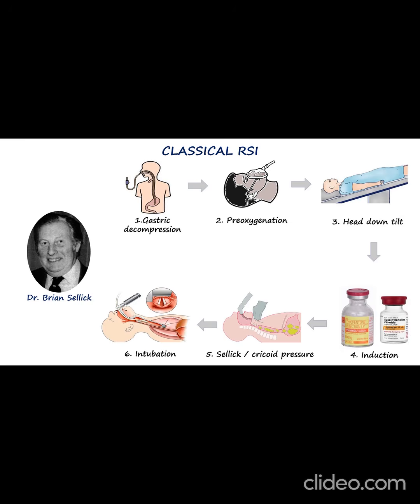The defining feature of classical RSI is the avoidance of positive pressure ventilation between induction and intubation to prevent gastric insufflation. The entire sequence is executed as a single continuous process, typically completed within 60 seconds from drug administration to confirmed tube placement.